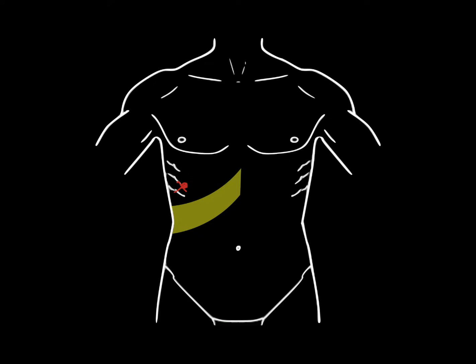Another technique you can use is you can roll them to the right lateral decube and try that. I don't have as much success with that, but I know people that do perform it that way. I know some people in radiology suites, you can have beds that they can lay prone and you can reach around them and scan. If you're in an emergency department or your clinic, you could have them kneel down on their knees with their hands on the bed and also look that way. But typically, I'll just try the supine, left lateral decube, and then I'll look through the ribs if I need to.